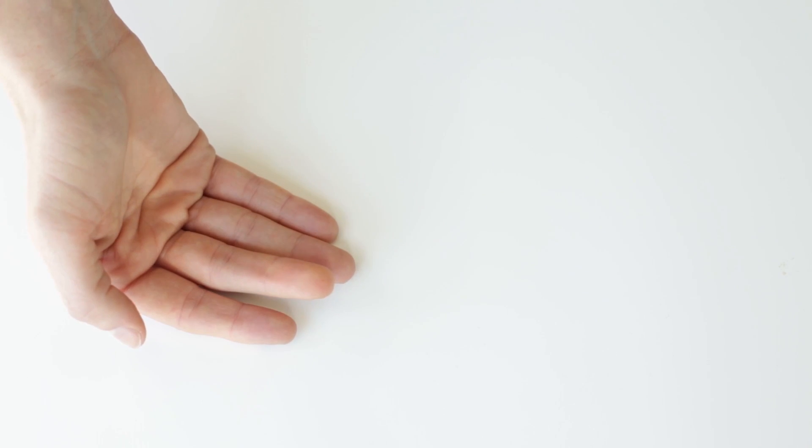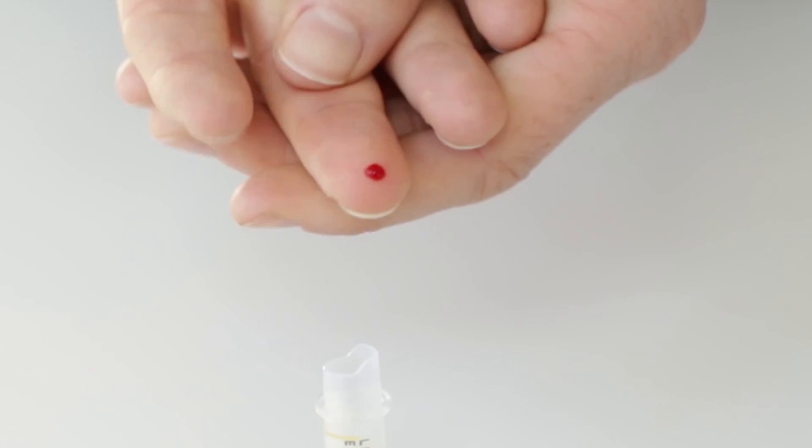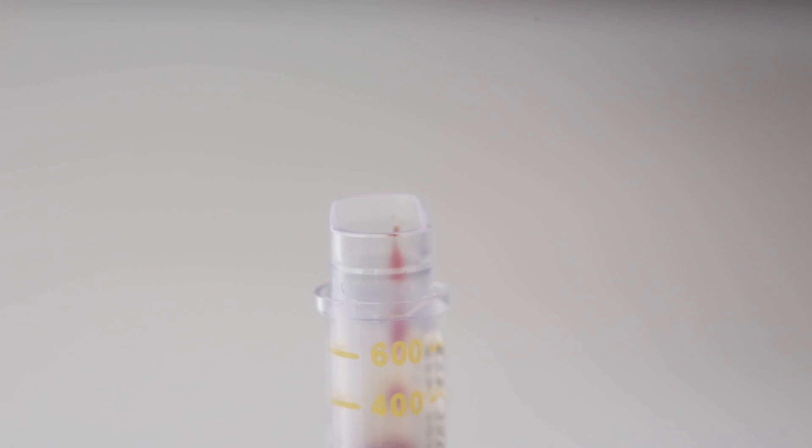Wipe away the first drop of blood with a clean tissue. Gently massage your finger from the knuckle to the tip and allow the drops of blood to fall into the tube.